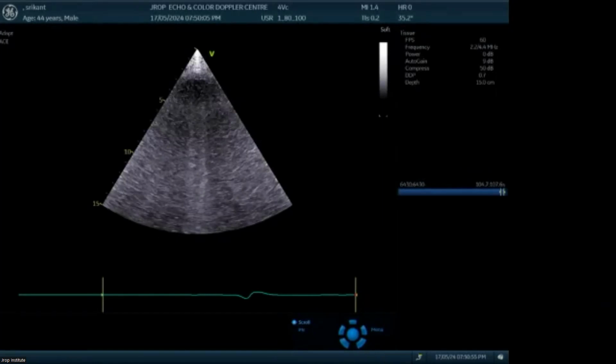Sir, what is the difference between RVSP, right ventricular systolic pressure, and mean pulmonary artery pressure? Okay. RV systolic pressure is the pressure gradient between RV and RA. Then mean pulmonary artery pressure is the pulmonary artery pressure at one particular point. We look at all the flow velocity which is going through the pulmonic valve. What is the average pressure of those? Mean pulmonary artery pressure is the significant thing for pulmonary hypertension. Whenever we talk of pulmonary artery pressure, we always talk of mean pulmonary artery pressure.